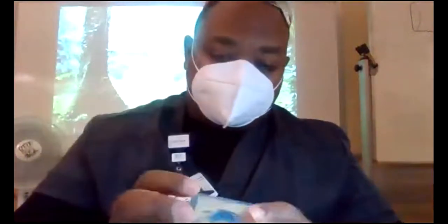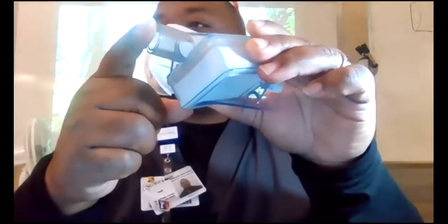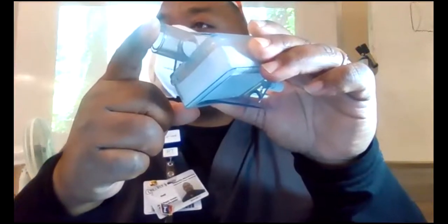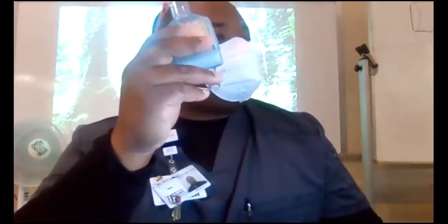Put your filter on this end, on the fat end. Only one side will fit. Now take a deep breath in and blow into that, but don't let go, and then suck it back in. You should feel the heat and the moisture come right back to you. That's your heat and moisture that you just gave it. You blew that into this special sponge, and it collected your heat and moisture, and then you inhaled it right back in.